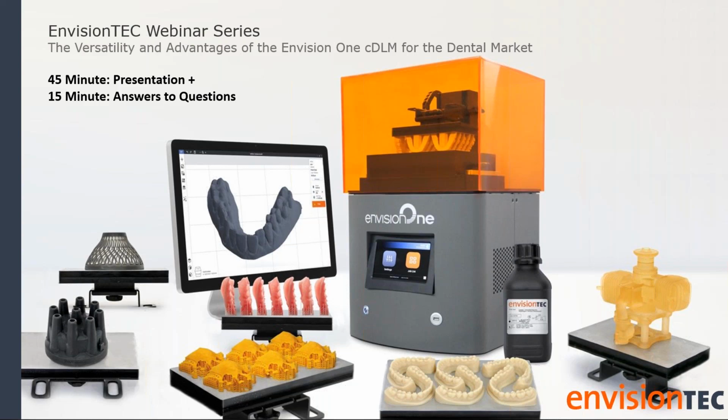So I have another question here. Is anyone on the market able to print ortho aligners? Yes. So we're talking about the ortho aligner, like the suck-down models. Everyone in our ortho space is able to print the ortho aligner models very, very easily.